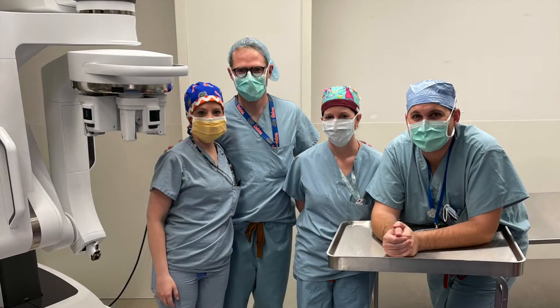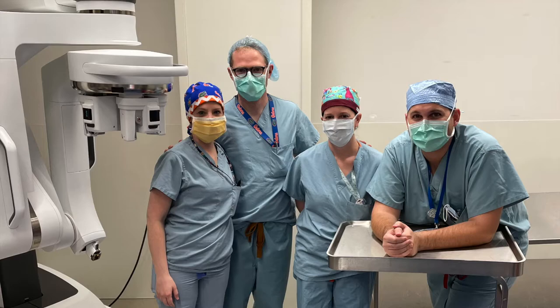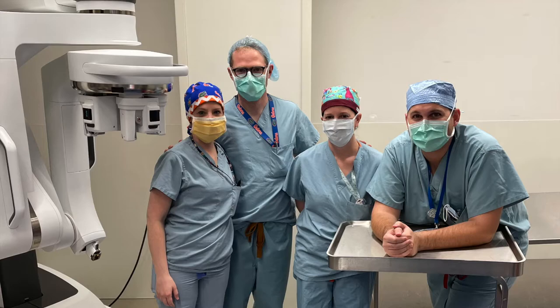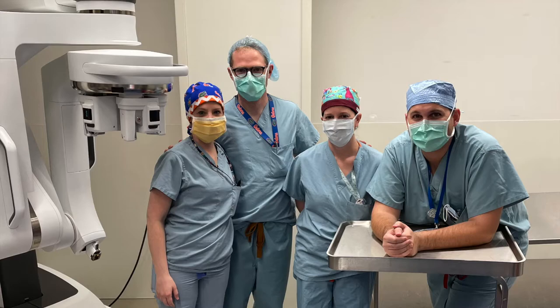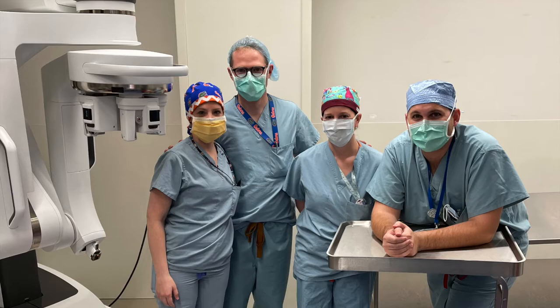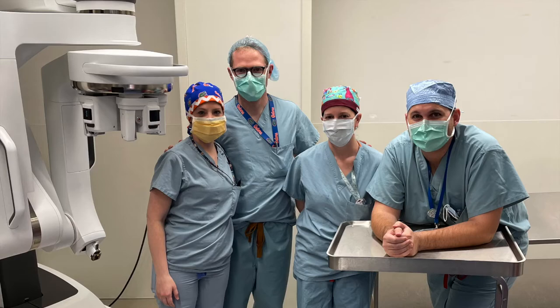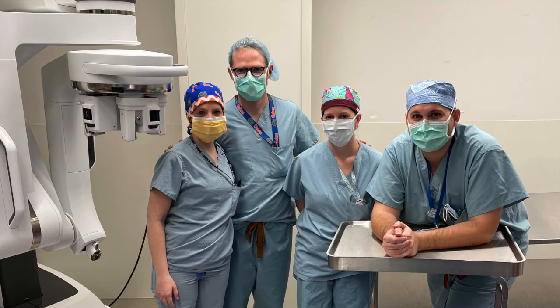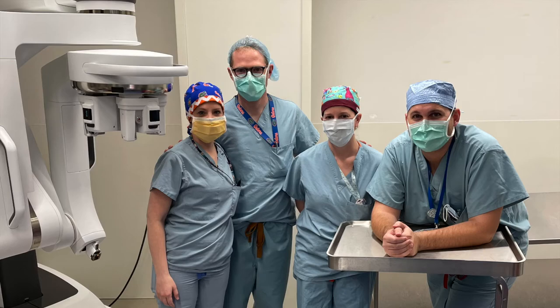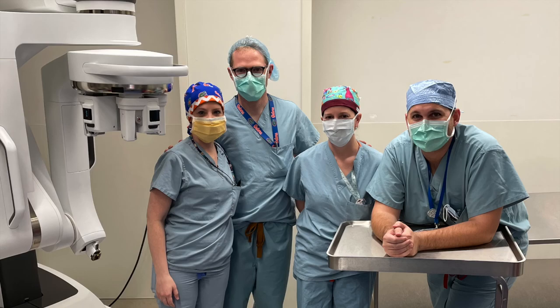Finally, I need to give credit to my surgical team that took on this task of learning the SP system and performing this surgery in a very safe way. This is my nurse on my right, my tech on my left, and on my far left, my resident. All these individuals took great pride in learning and practicing the DaVinci SP robot for this procedure, which was the first procedure we did at University of Florida on the DaVinci SP system.